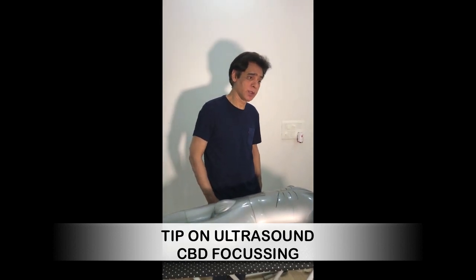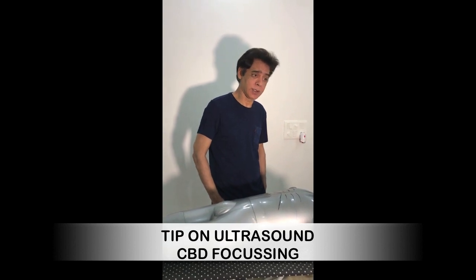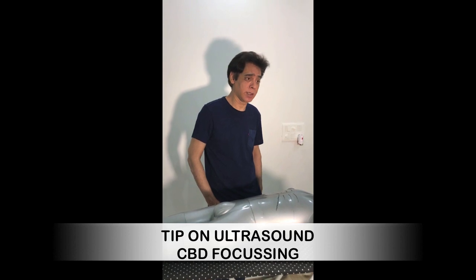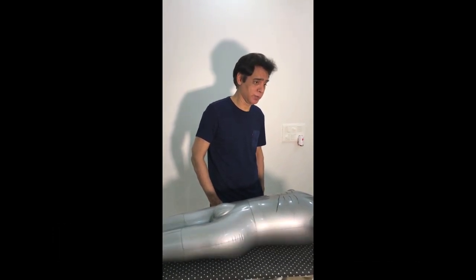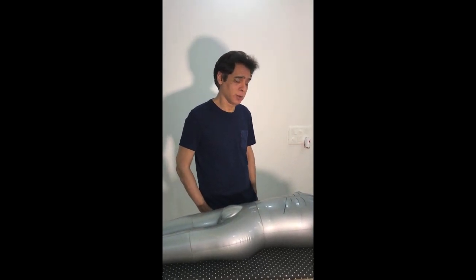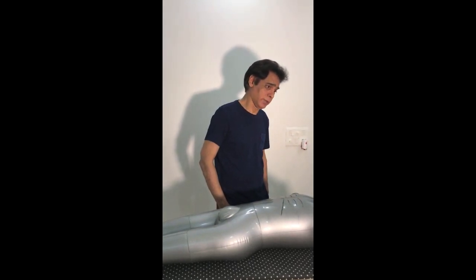Now, we have come across many reports where people write that the proximal part of the CBD is dilated and distal part cannot be seen because of the overlying gas shadows. Now, this should not be the way of reporting.